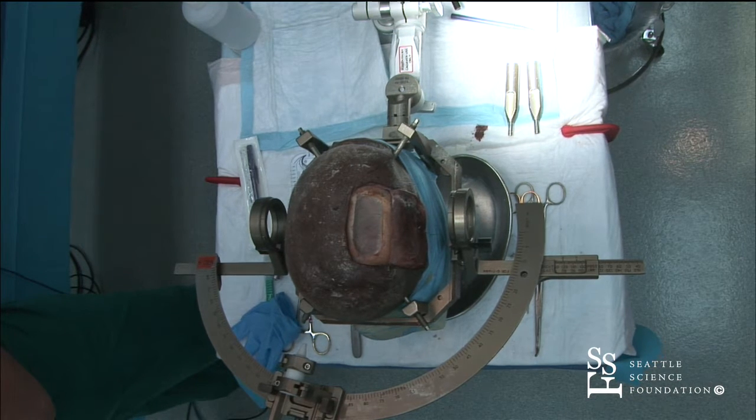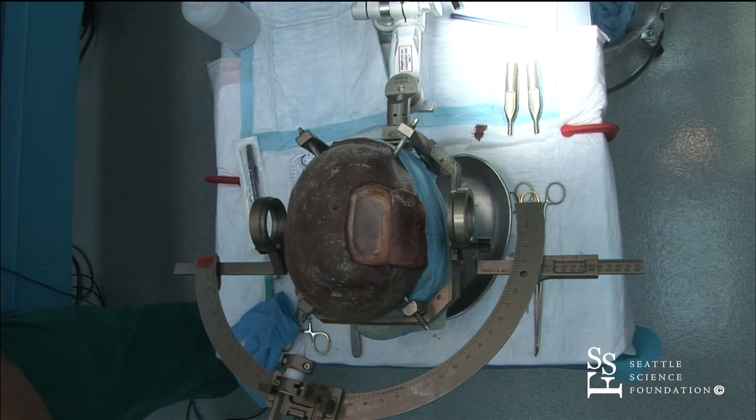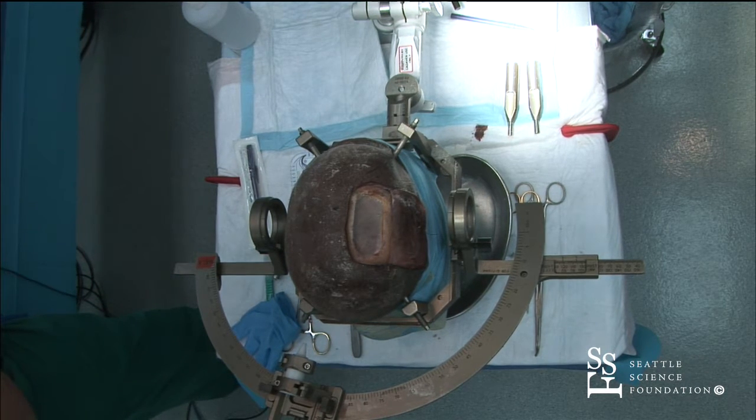Generally, if we can avoid the ventricle again, it's probably better, because it is possible that when you place a depth electrode, if it's going through the ventricle, it could deflect off the ependymal wall of the hippocampus, and it is a little bit high angle when you're approaching it from the back. So it's probably better to go underneath the ventricle if you can, although I've had many patients where we've gone right through and it's ended up fine.